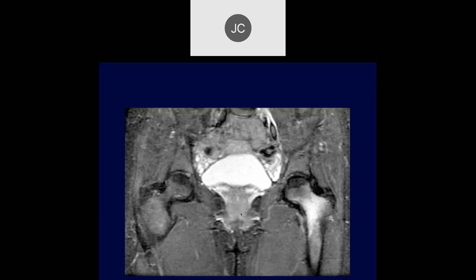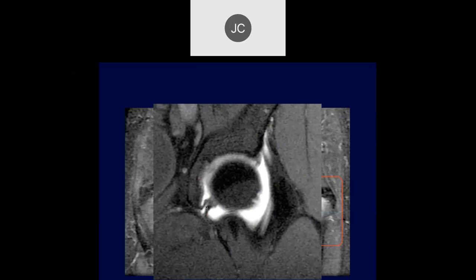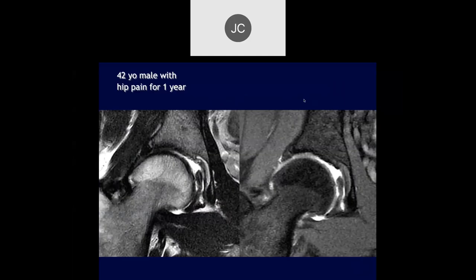Tason — there's some marrow edema in the femoral neck on the left, and irregularity and thickening of the transverse ligament with increased signal and some fluid adjacent to it. This was a patient who had trauma — a trabecular bone injury — but also had a high-grade partial tear of the transverse ligament. It was treated conservatively, but at least by MR we could make the diagnosis.